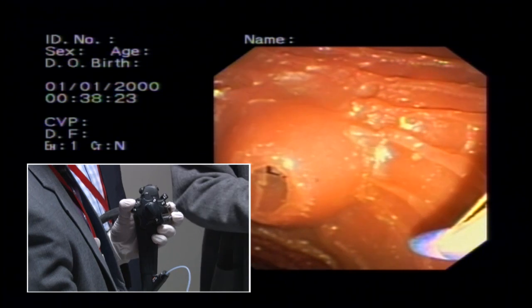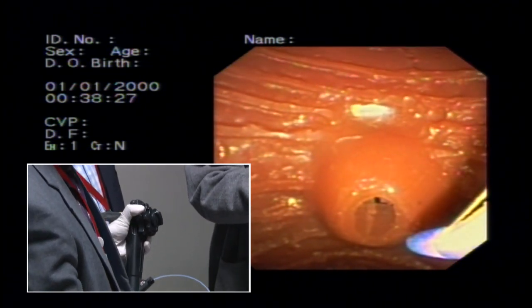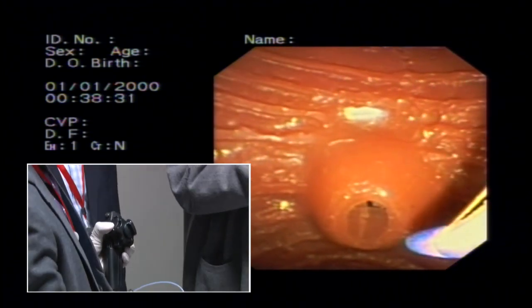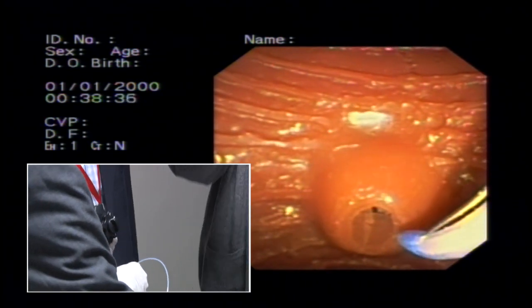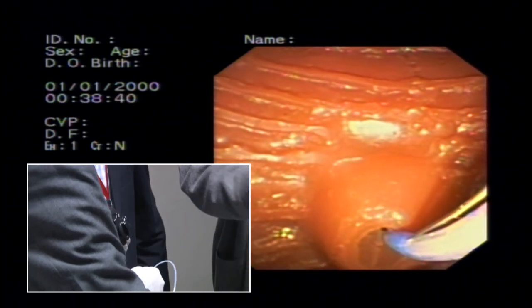So when we are doing ERCPs, we are actually talking. Scope is here. I'm doing everything. Abdullah has been with me. Shahid has been with me. It doesn't stop. Whatever, the phone is also going on, talking is also happening, teasing and jokes also happen. Virus in cannula, we are waiting, whatever.